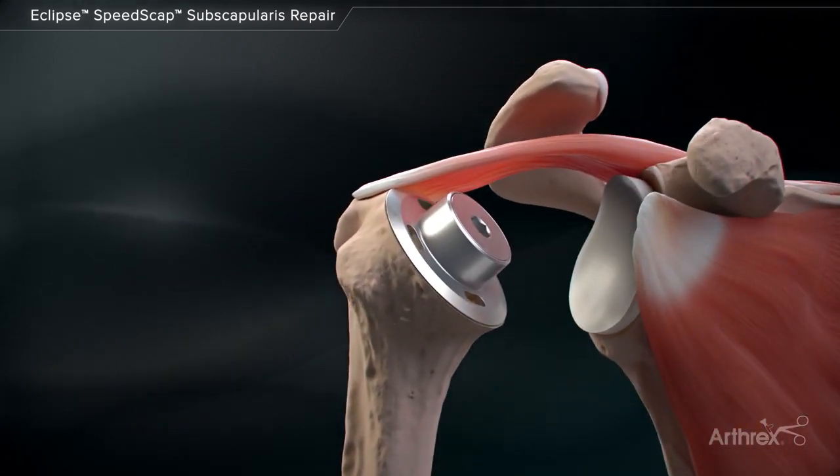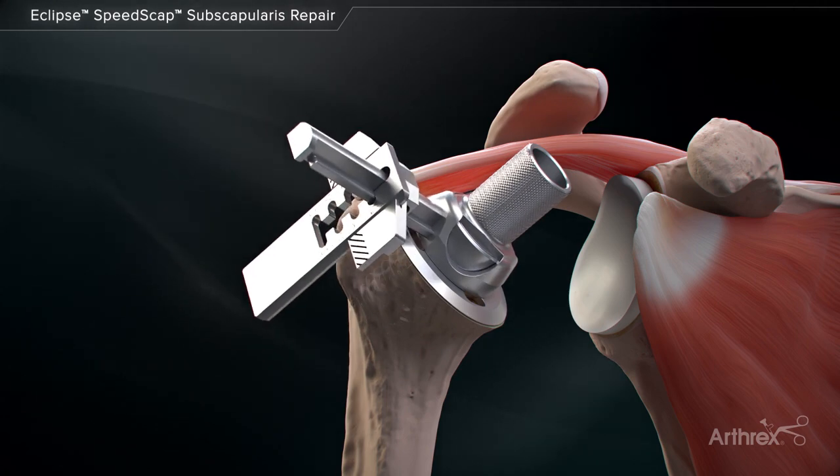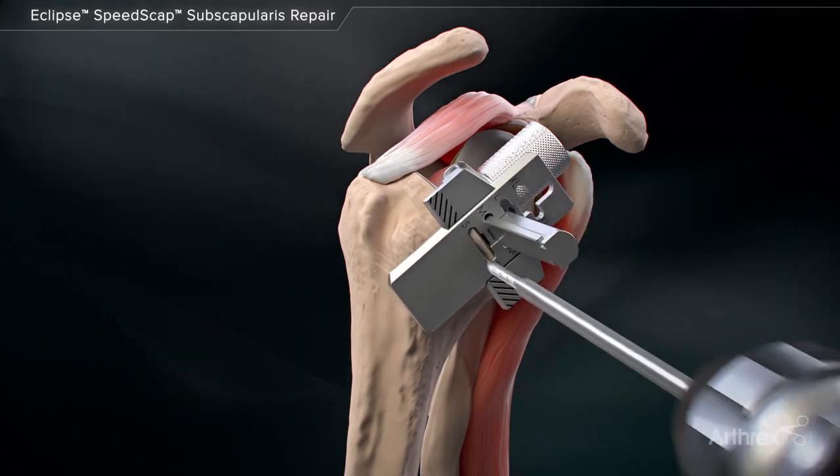The Eclipse trunnion adapter is placed onto the trunnion, appropriately sized to the implanted cage screw length. This provides an outline of the cage screw so it can be avoided during both medial and lateral row humeral anchor preparation.